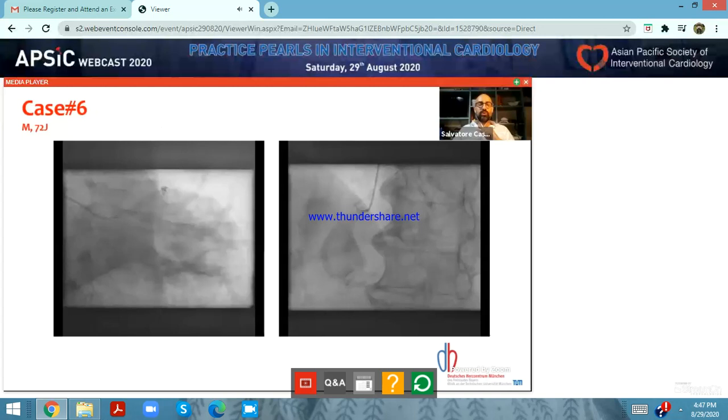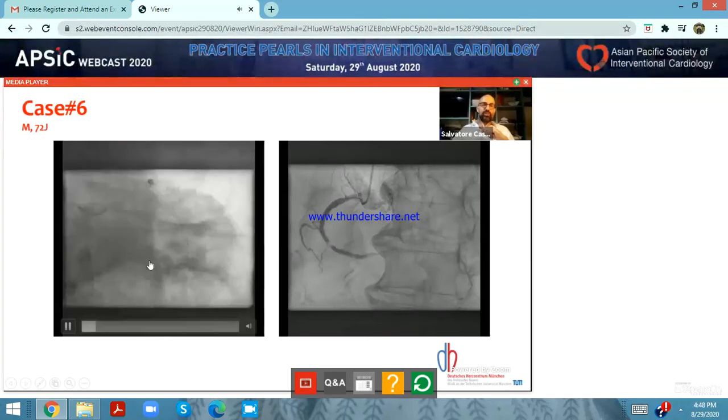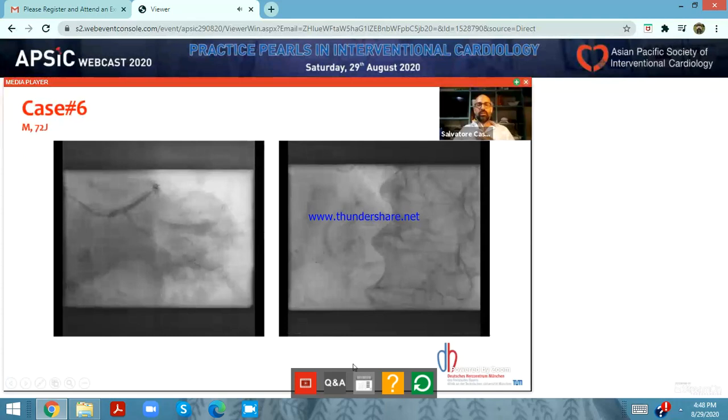And for sure, we also use the balloon for lesion preparation and in patients who have no possibility to be prepared in another way. You can see this patient was transferred to our institution because we are a referral center for very complex, high-risk and indicated procedures. Distal left main, very diseased, a lot of calcium, no option for bypass because there are stents previously implanted up to there, chronic occlusion of the distal LCX and almost occluded RCA between two stents that had been implanted in the past. So the first thing we did, we gave a little bit more flow in this vessel.